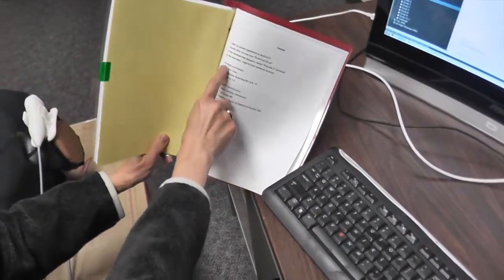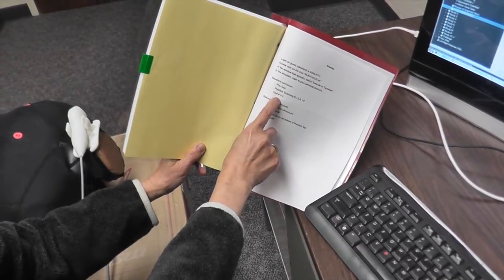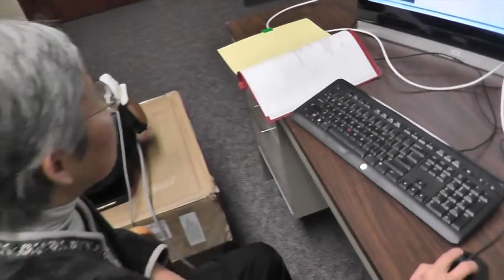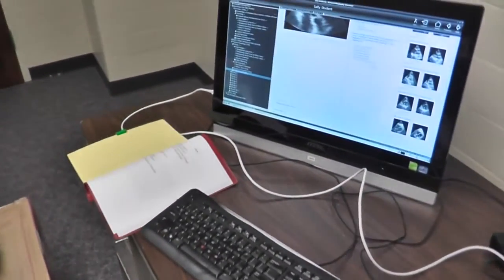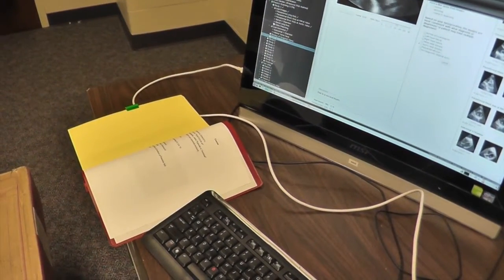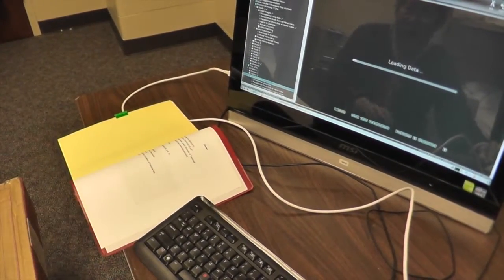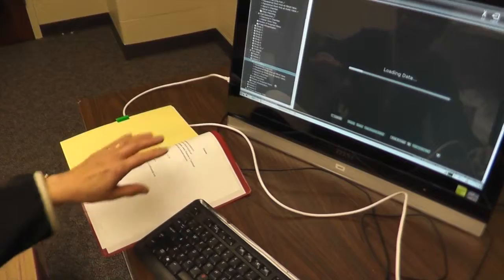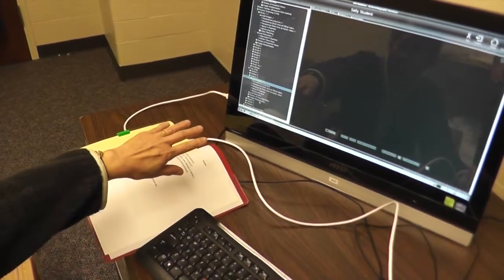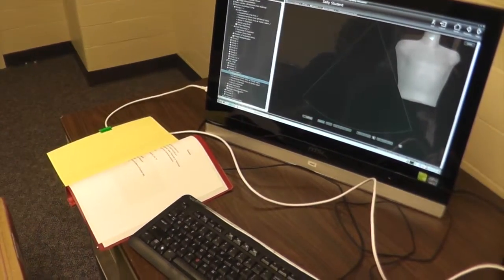So after you've gone through the practice curriculum, then you can take the test and open the cases that are listed in your course manual. And on the left navigation panel, click under Test to see those cases. When you click one, you'll see the same kind of interface where you have to load the images and acquire the images, review them, and answer image interpretation questions, just as you did before.